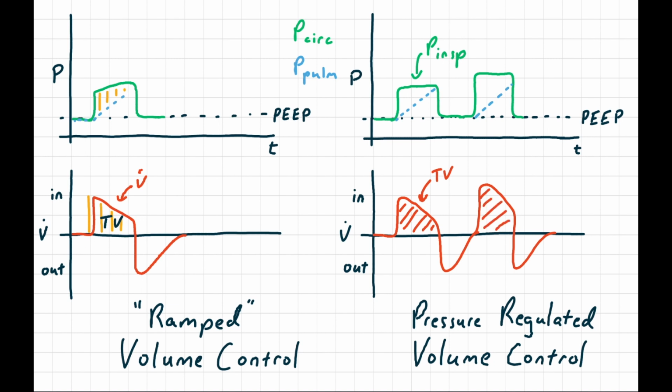So in this ventilator mode, your ventilator computer is constantly monitoring the tidal volume, and it will automatically change the inspiratory pressure as appropriate. So it is a pressure limited mode because the pressure is what defines the valve behavior during inspiration, but the variable that you set as the operator is the tidal volume, which is why they give it the name volume control.